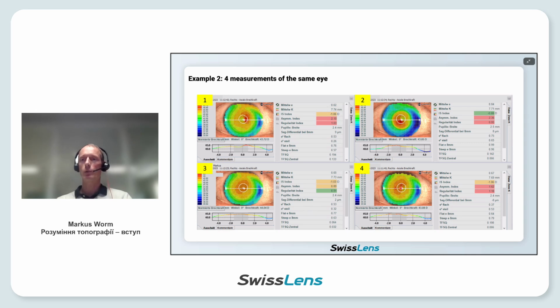They are at another position, and that is typical for problems coming from the tear film. If this red area is always at the same position, we can be sure that it's coming from the cornea. But to be sure, let's take a look at the tear film.